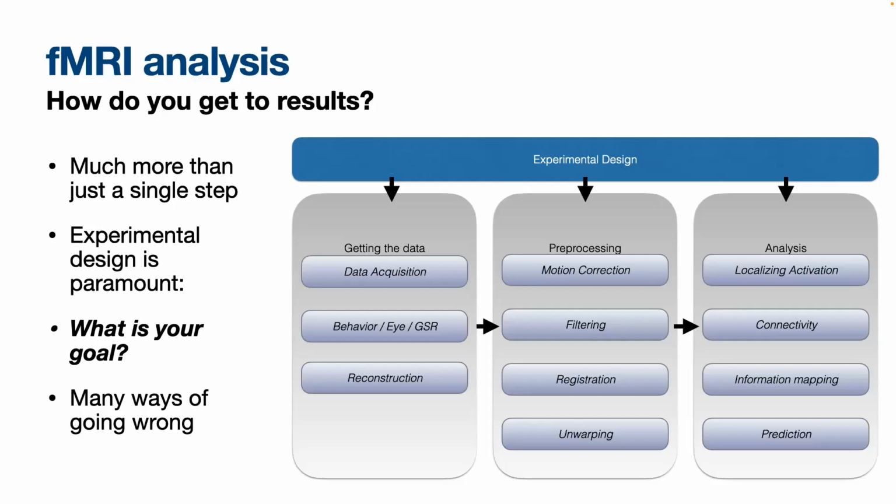That means that we have to perform a co-registration step between the functional data and the anatomical data, right? So we have more detail in terms of where things are. And like I showed you, there was a hole in my frontal cortex. These fast fMRI images, they are warped. When we say that something is somewhere in the brain, according to one of these images, it has image-related warping artifacts that we need to correct for. So we'll also go into that, how that works.